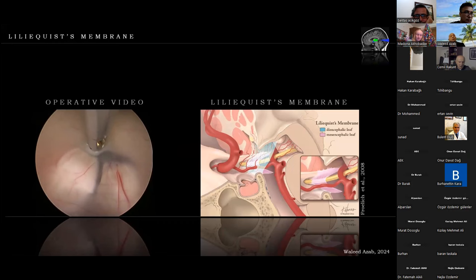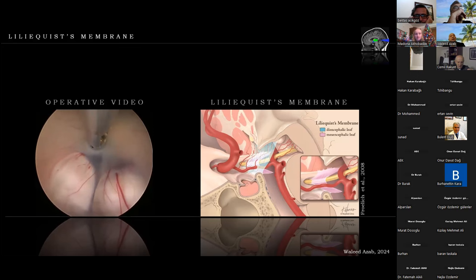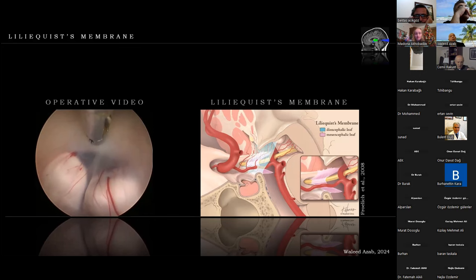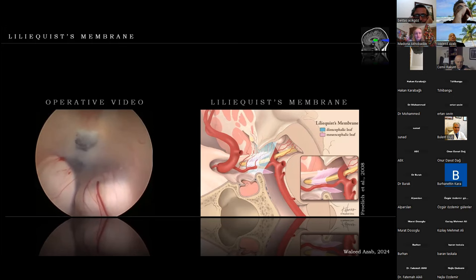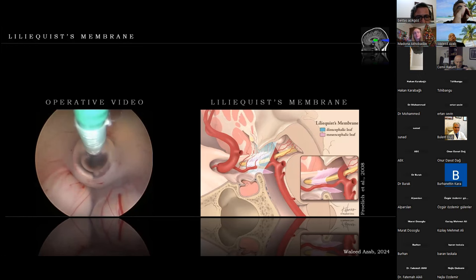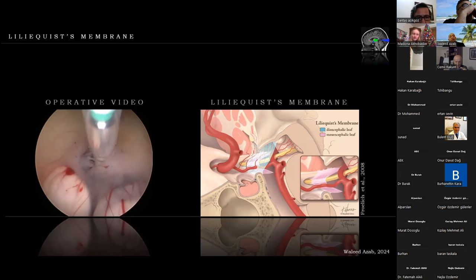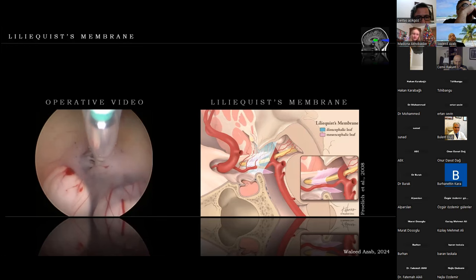Here is a video of the procedure. The same technique is applied at the posterior part of the dorsum, opening the tuber cinereum. The forceps encounters some degree of resistance, frequently found when the Liliequist membrane is encountered. An opening of the floor is performed, and then the Fogarty catheter is negotiated through the initial small opening within the Liliequist membrane to enlarge it. Partial inflation of the Fogarty catheter is performed again and again, staying for some time. In most cases, this is sufficient to get the Liliequist membrane open.